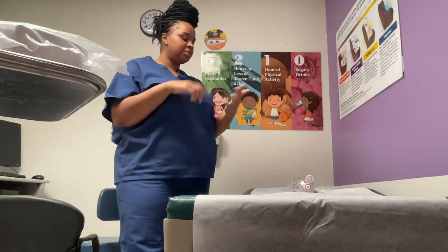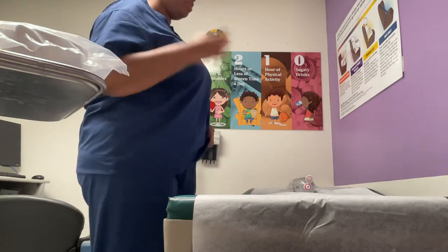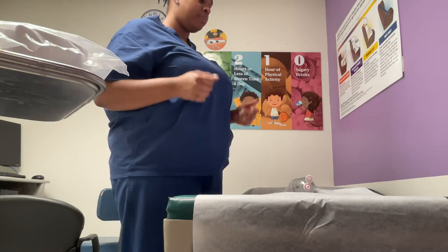I'm reviewing the patient's chart, making sure the patient has no physical limitation. I'm going to verify that the patient is getting the catheter by checking the medical orders.